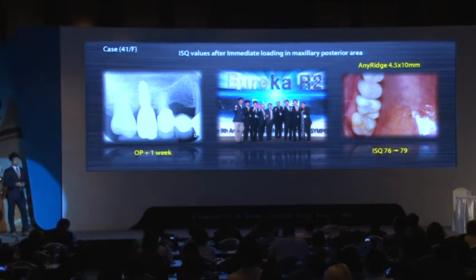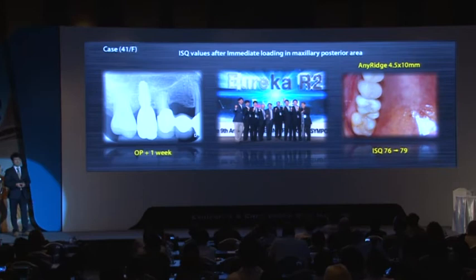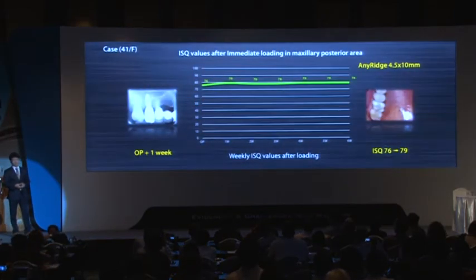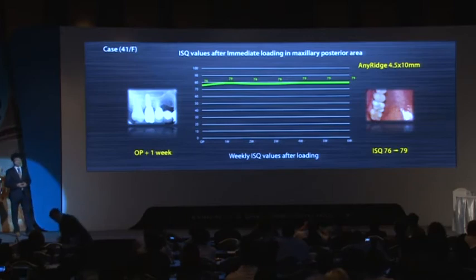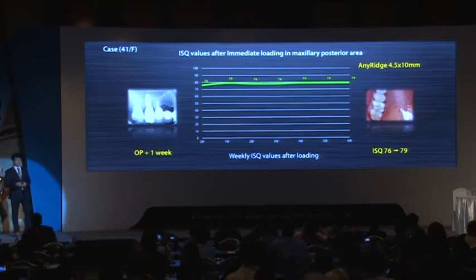Actually, to unscrew the final prosthesis after immediate loading is a very dangerous and very scary thing. But I had to do it because he's my senior. And this is the result. As you see, ISQ values were very stable with time, even after being loaded with the final prosthesis. I like this case, and I like Dr. Kim, because this is my first case in which I measured ISQ values after loading.